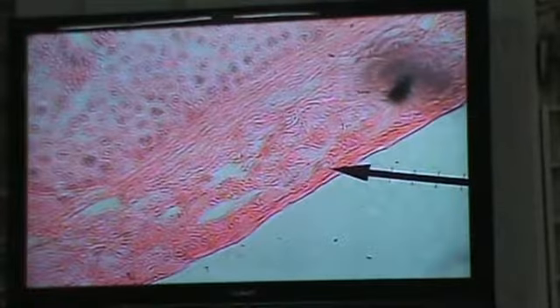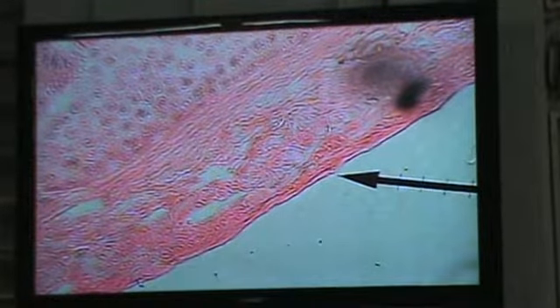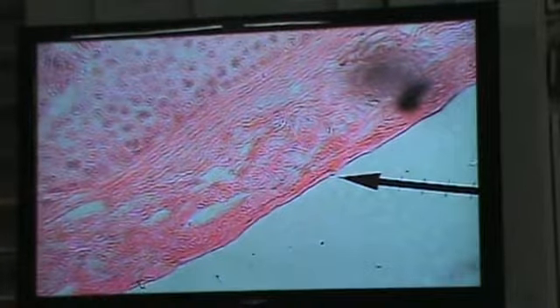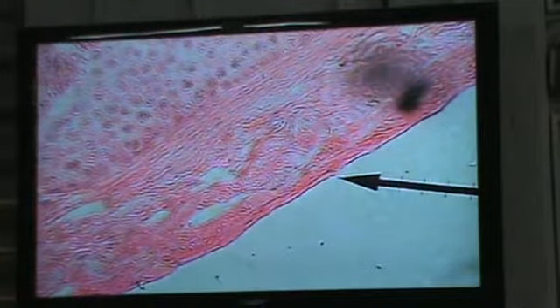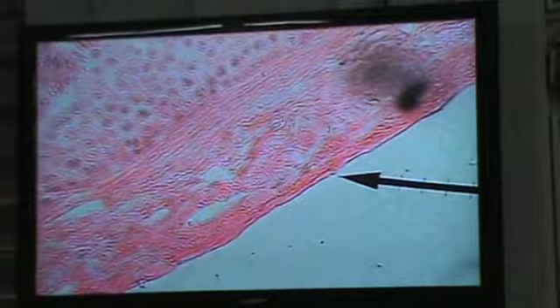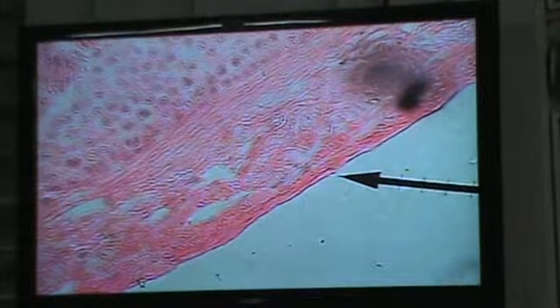So this will form a good introduction. But let me just get back to that to say now that the testis is covered by a mesothelial lining. Okay, and that layer, not exclusive to the mediastinum now, that layer is called the tunica vaginalis. And the tunica vaginalis has two layers, a visceral layer and a parietal layer. And what you're looking at here is the visceral layer, okay?